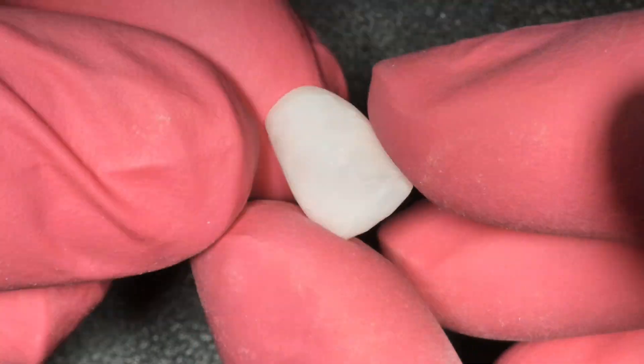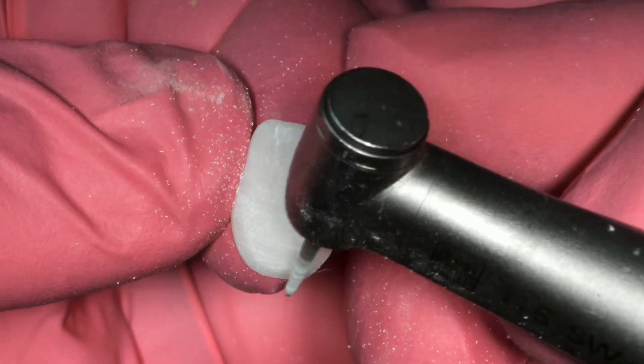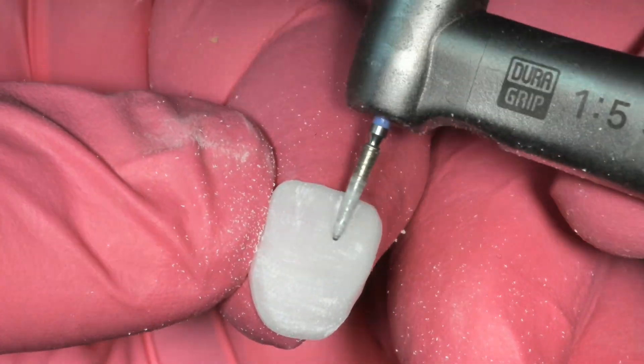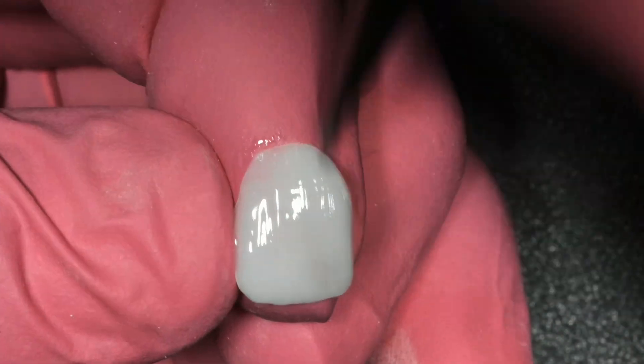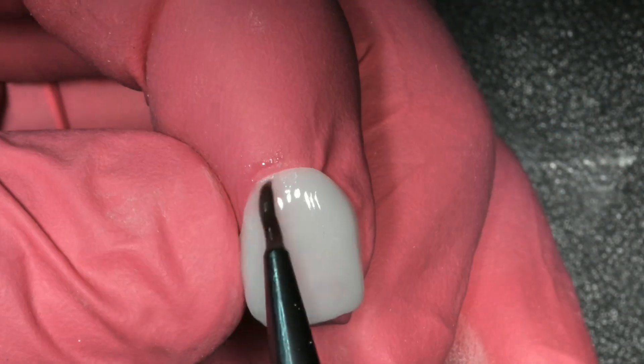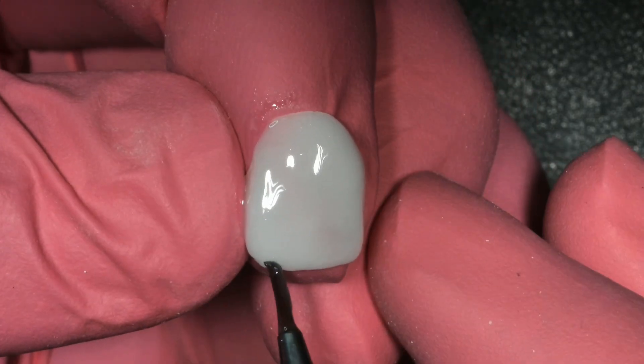Now we're off to finishing the prints. Off the printer, we're going to use this felt pad to smooth and further thin them out, because you have to print them at about 300 microns — but we can thin them. Here I'm adding some texture with a coarse diamond, infusing liquid resin on top of that surface. This is the candy coating technique that we discussed at Mod, using native resins and Empress Direct stains interdiffused into those native resins.